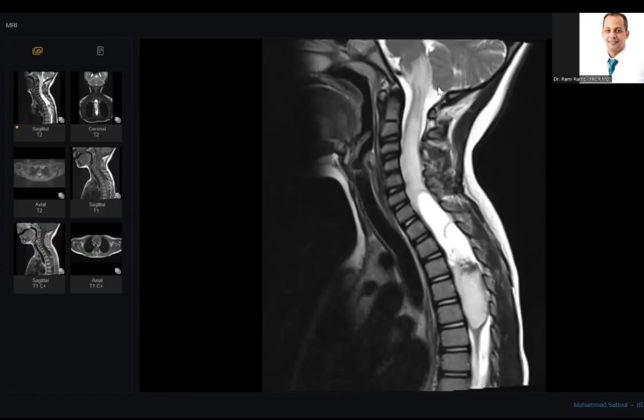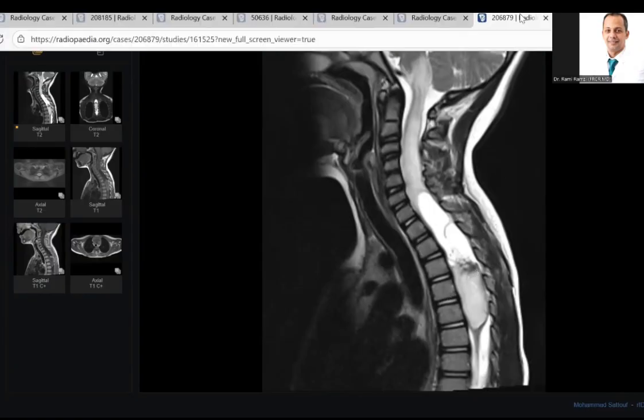So when you suspect a ruptured dermoid on brain MRI and you don't find the primary pathology, ask the examiner, doctor, I want to do a whole spine MRI, because the source of fat will be a teratoma within the spine, either cervical, dorsal, whatever. This is very important.